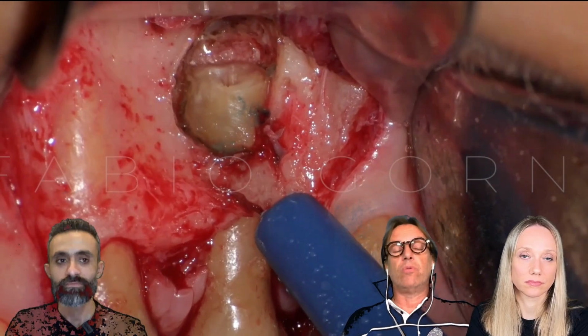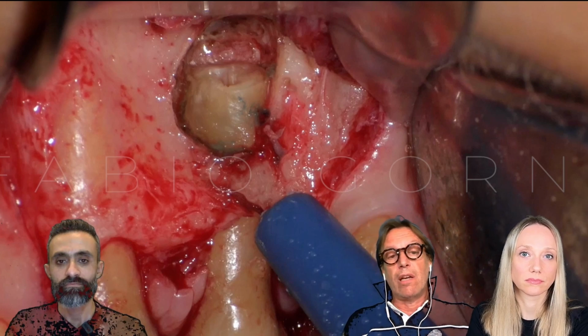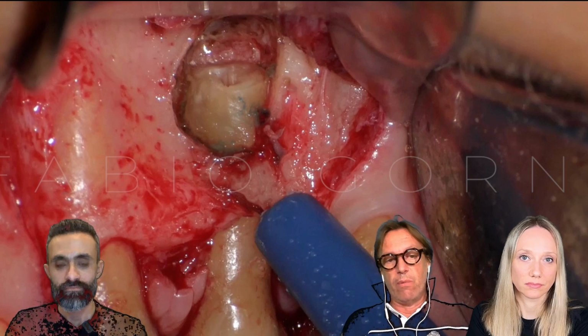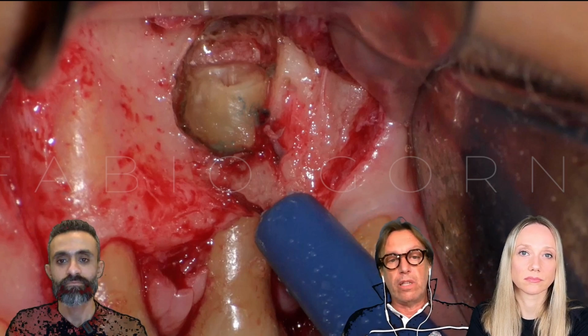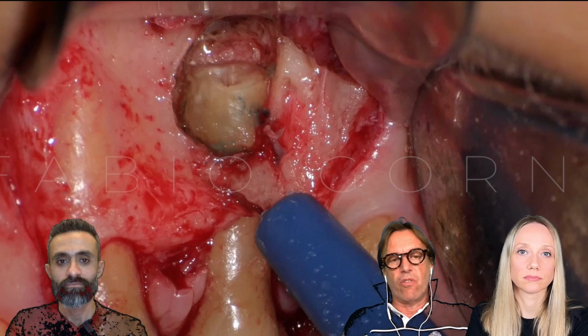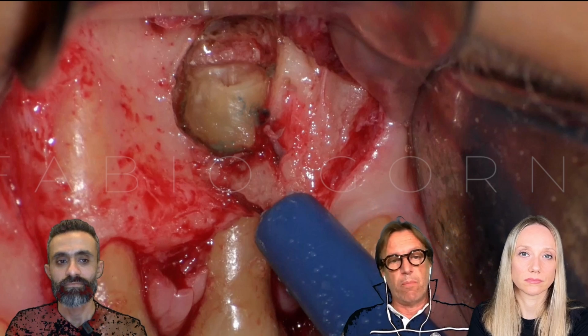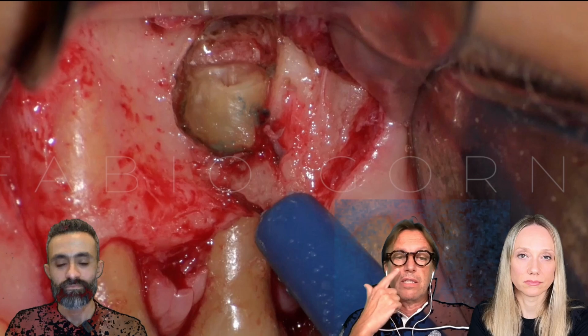You can use the micro mirror just to check inside the root canal system, if you want, to check the quality of your cleaning. But with a 7 to 10 degree bevel, you can check everything with direct vision, and trust me, it is much easier to perform the surgery.